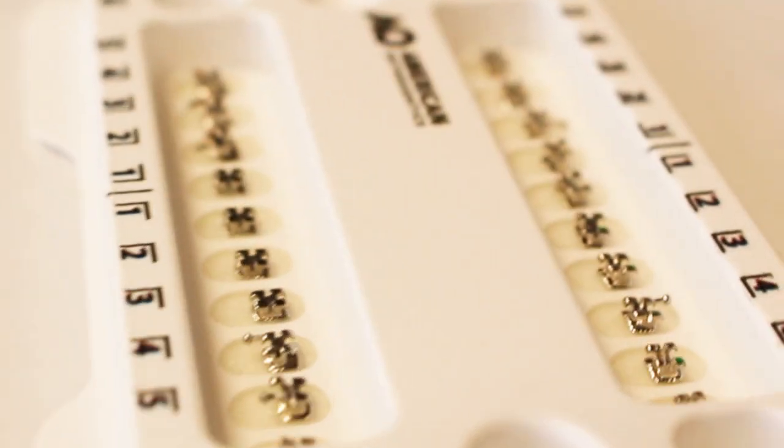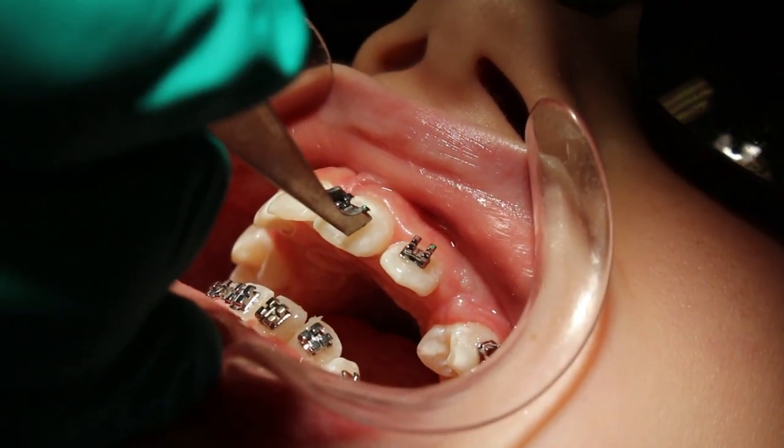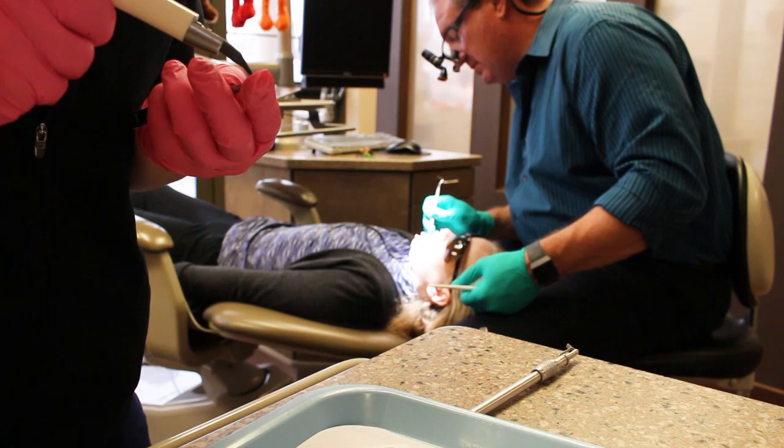I come into the picture at that point. The assistants will give me the braces and I'll place them on the teeth. We actually put on a pasty type glue on the brace that's kind of the same as the liquid we just put on. So when those go together, they'll stick to one another because they're basically the same thing — one's a paste, one's a liquid.